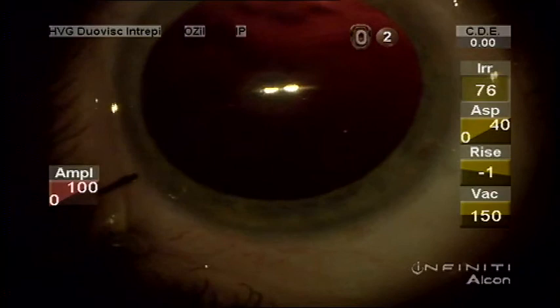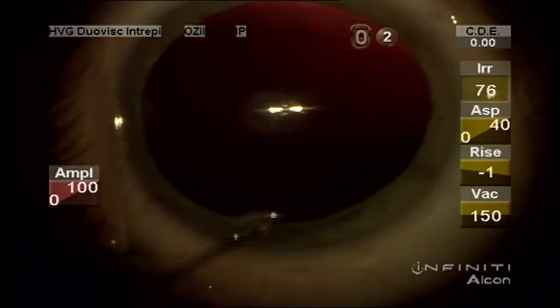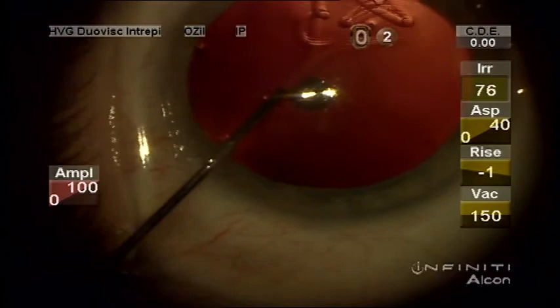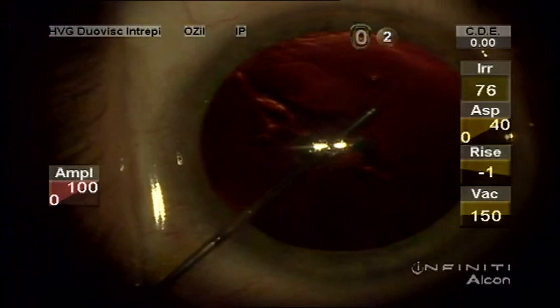And here we see the patient's cataract, the way it's developed, that little button right in the center of the pupil, probably posterior polar cataract. And this is a cataract that has a bit of mechanical attachment to the capsule membrane, so some precautions will be taken by the surgeon here to ensure that the capsule stays intact. So a little bit different cataract surgery.